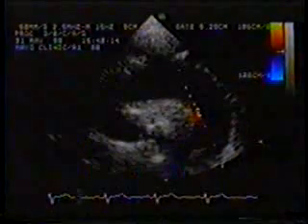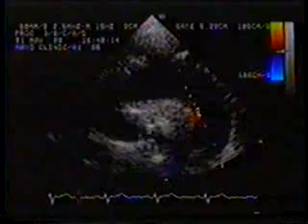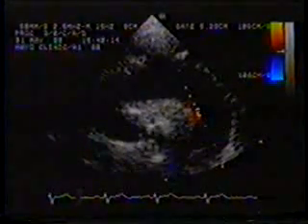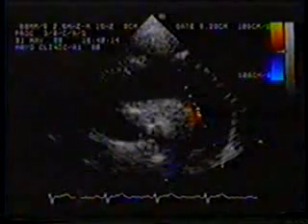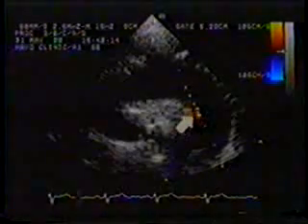Several cycles show slight, early diastolic flow reversal, encoded in red because the flow is toward the transducer. To accomplish the pulsed wave examination for flow reversal, we most commonly use a sample volume position in the descending aorta about a centimeter or so beyond the left subclavian artery. Here we are utilizing flow imaging to guide sample volume placement.